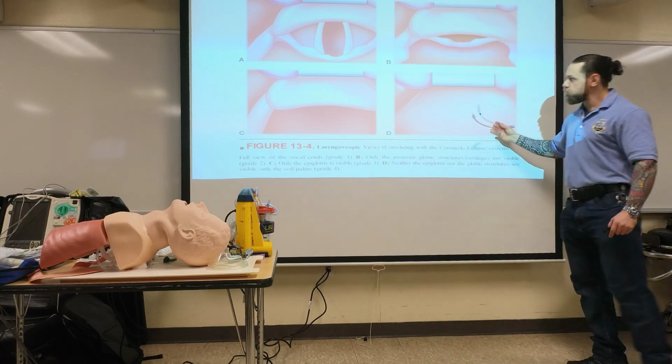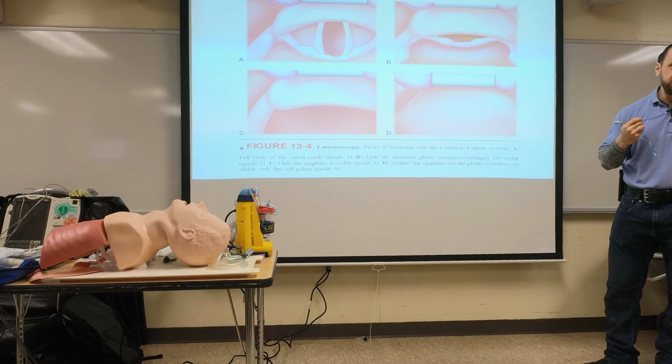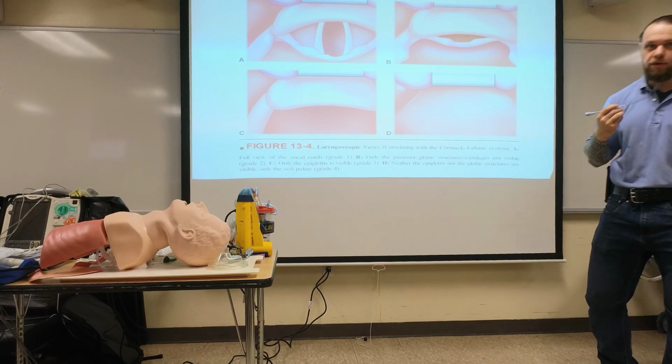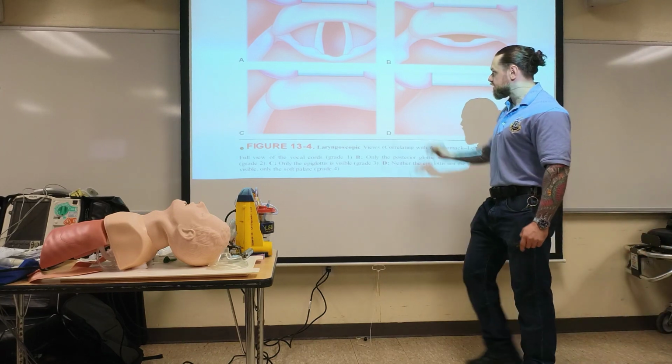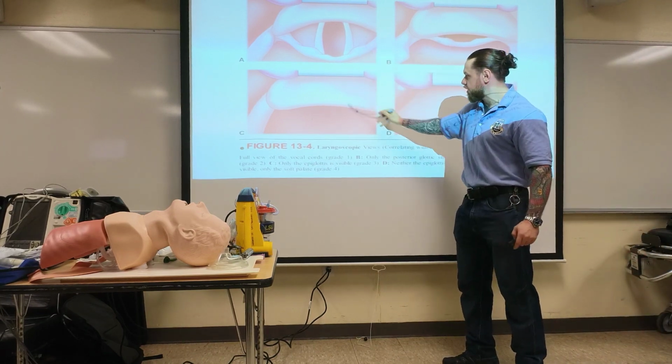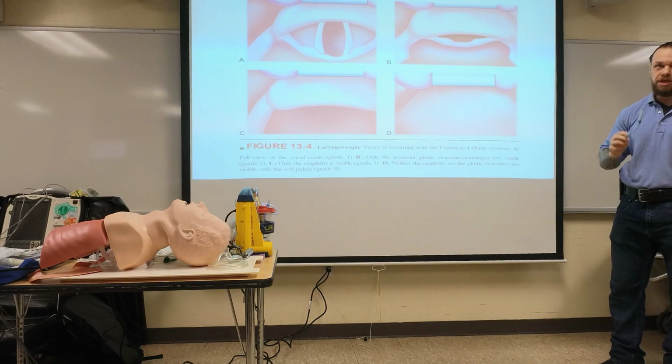With this technique, you may try the bougie, and it may not be successful. And with this one, you're probably not going to get an airway. They're probably going to need a surgical airway. They're going to cut the neck. It's called FONA, front of neck airway access. You could probably get access here. It's going to be very hard here. You will not be able to get access here without surgical intervention, which you cannot do.